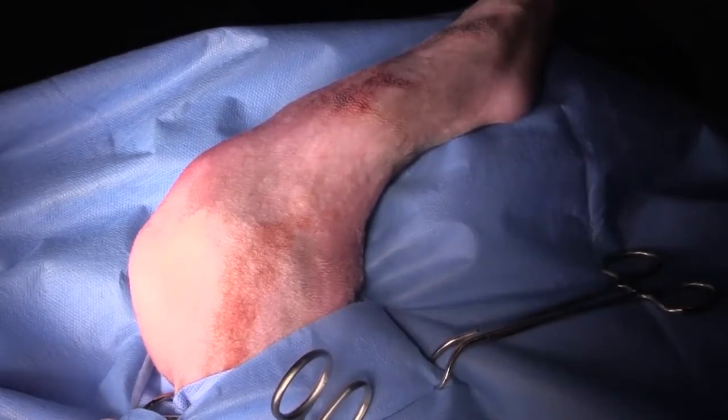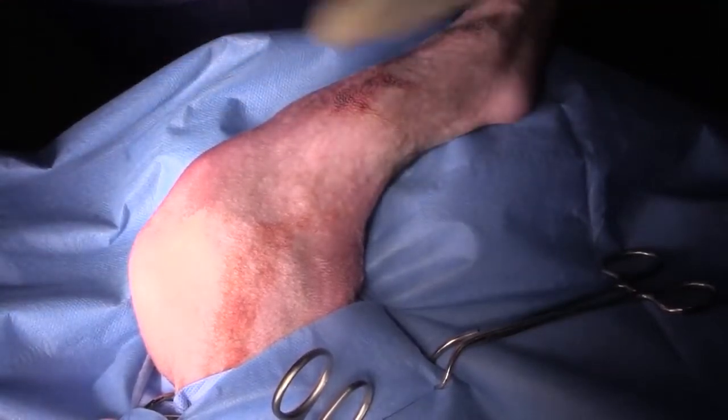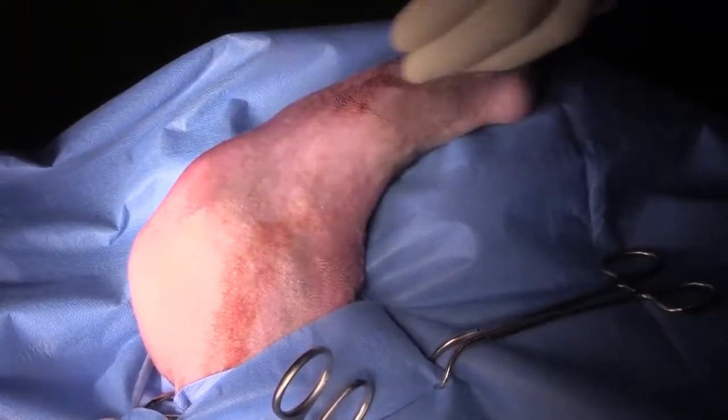Hi guys, this is Charles. I'm one of the surgeons at Southpaw's. Today we're going to repair a tibial fracture in a five and a half month old puppy, very similar to the one that I did on Saturday.